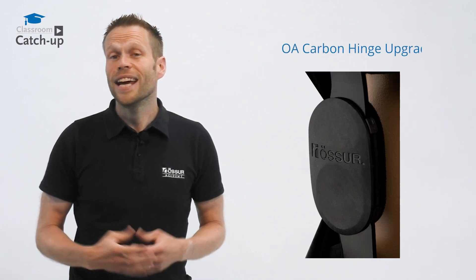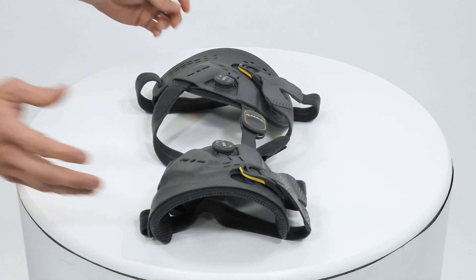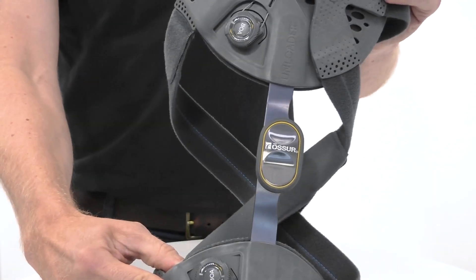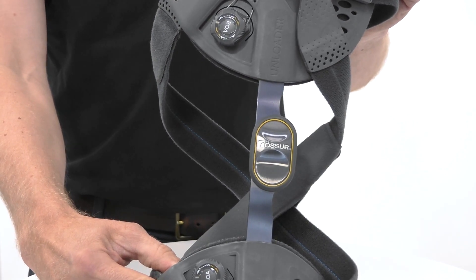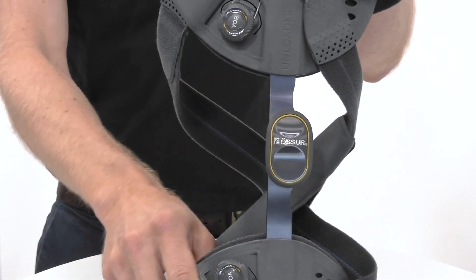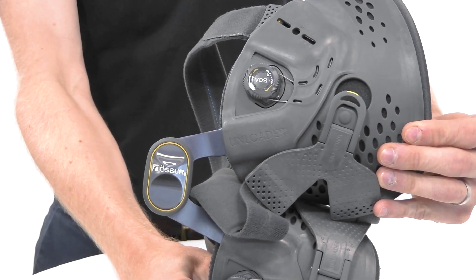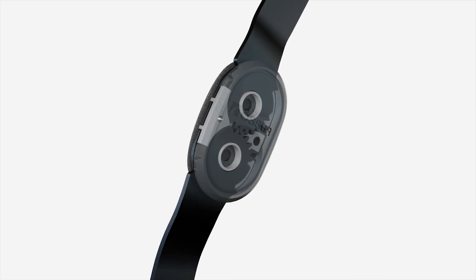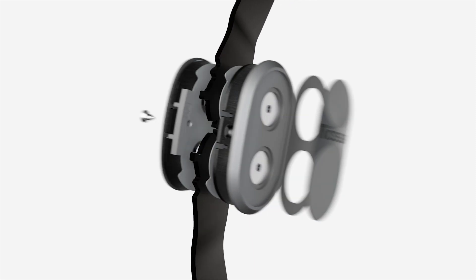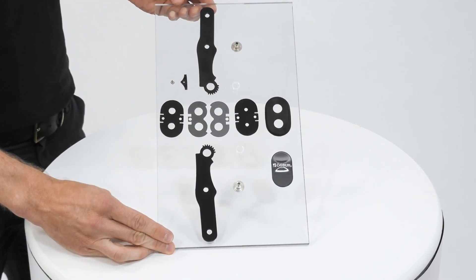We have hinges on most of our bracing portfolio and have put years of hard work and obsessive attention into every detail of the form and function of how they work on our orthoses. This is the hinge as used in the Unloader One range, the Rebound Cartilage, and the OAEs. It has a simple function of allowing flexion and extension within a controlled range from full extension to in excess of 120 degrees flexion. But when we look at what parts go into this, each of these parts are a potential point of failure, both in terms of mechanical function but also in our supply chain.